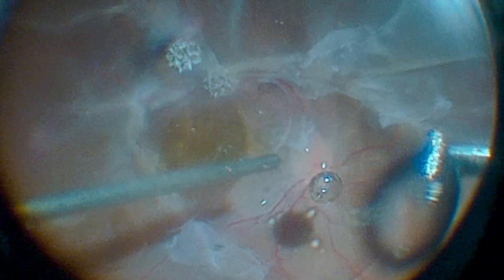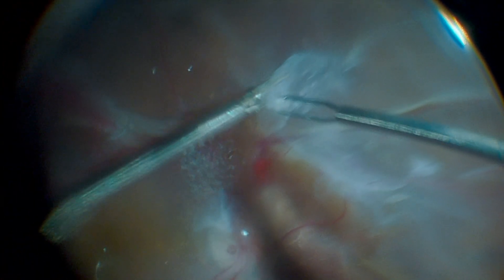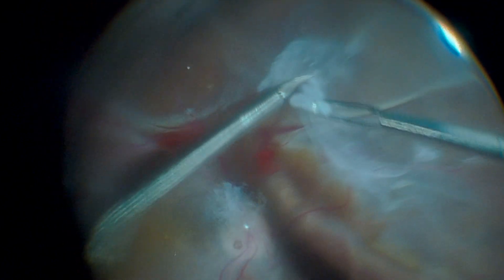Perfluorocarbon is used for posterior pole stabilization. The delamination of preretinal membranes is then performed using a bimanual technique with retinal forceps and curved scissors. Perfluorocarbon acts as a third hand for the surgeon, protecting the posterior pole from the traction exerted on the membranes. It is crucial to find an appropriate dissection plane for the scissors to avoid iatrogenic retinal tears.